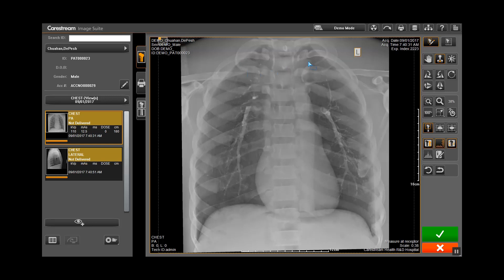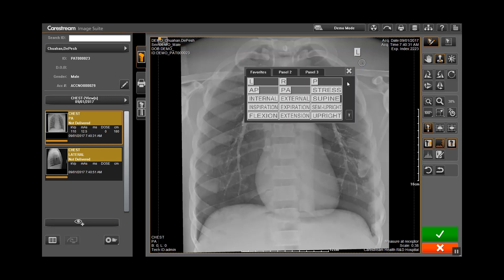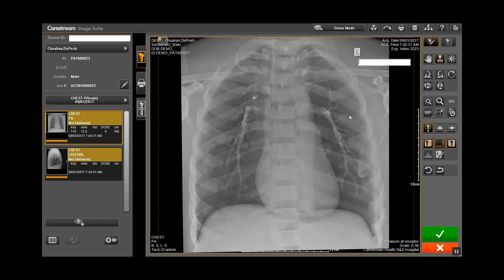To add a text stamp, click on the image to bring up the menu. In the lower right hand corner is an icon with a T. Click the icon and type in any additional text information required for the image.